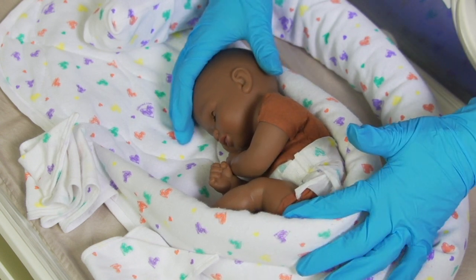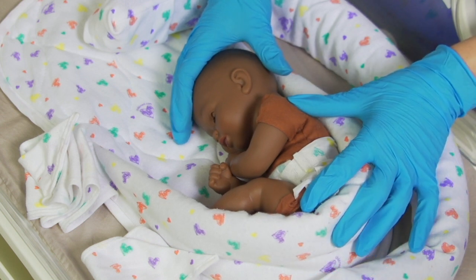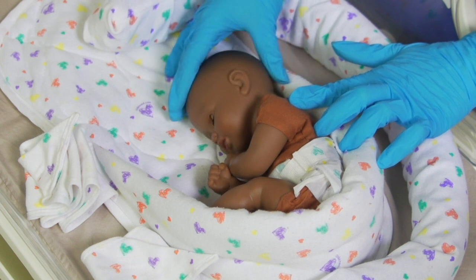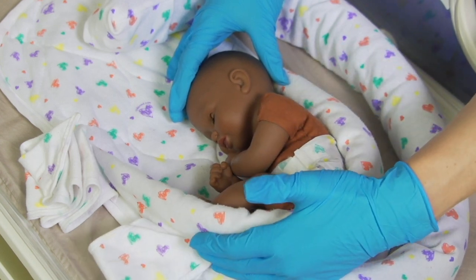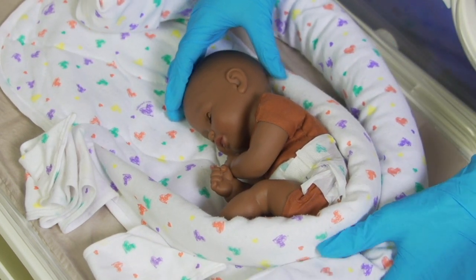Challenges of the side-lying position are proper alignment. Attention needs to be focused on keeping the shoulders rounded and neck slightly flexed, facilitating positioning so the infant's hands are near his or her face. Hips should be aligned and softly flexed, with the feet lightly braced. Add a bendy bumper, making sure to match the boundary height to the infant.